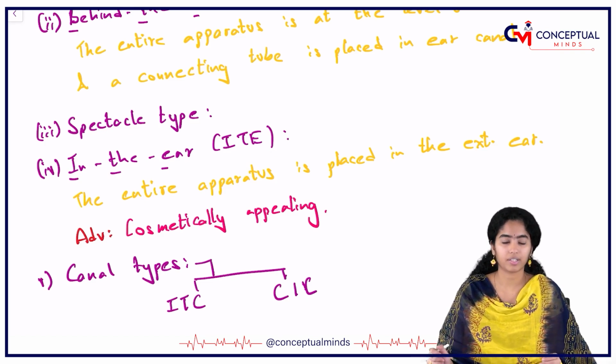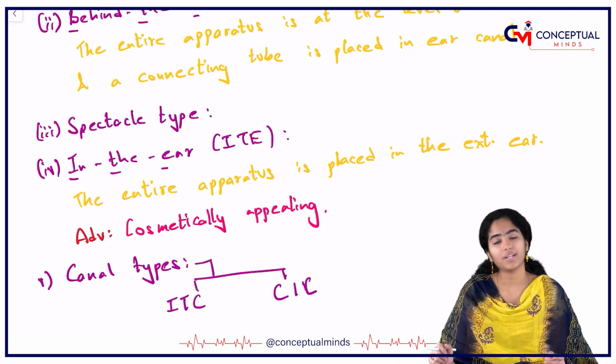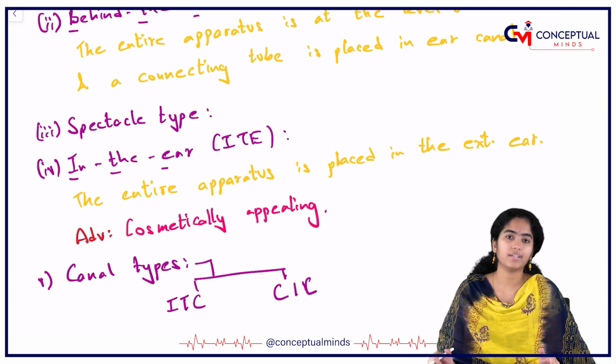Because hearing loss is there in tympanic membrane perforation, hearing loss is there. But do we do that? No. We try to surgically correct the defect. Now when you can surgically correct defects, why do you need hearing aids?